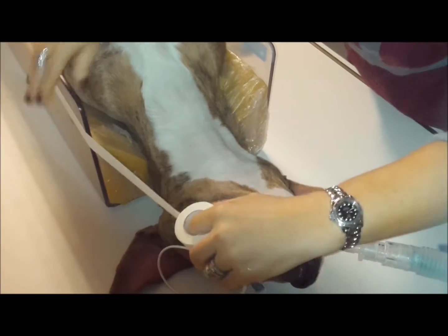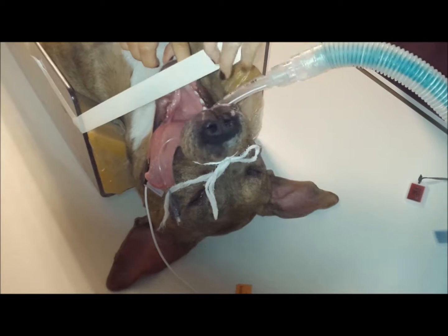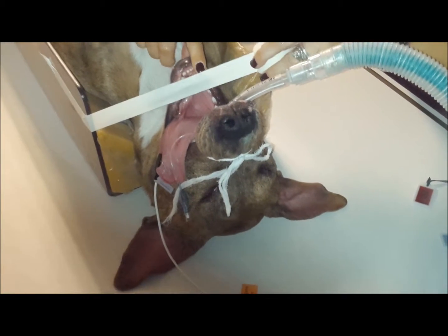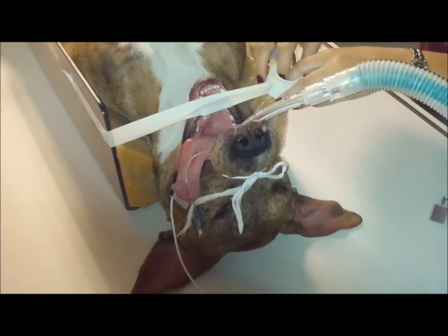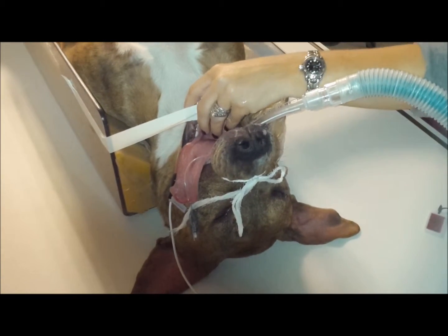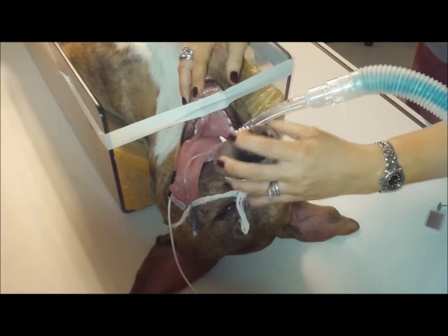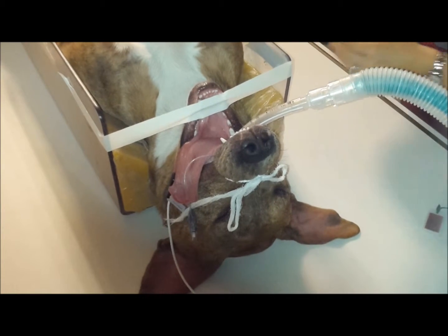You're going to utilize your box. However, you're not going to go around the front of the nose — you will just go across the mandible. I like to put my tape right on the canines if I can; it gives you just a little bit more traction. Typically most dogs will V out naturally.